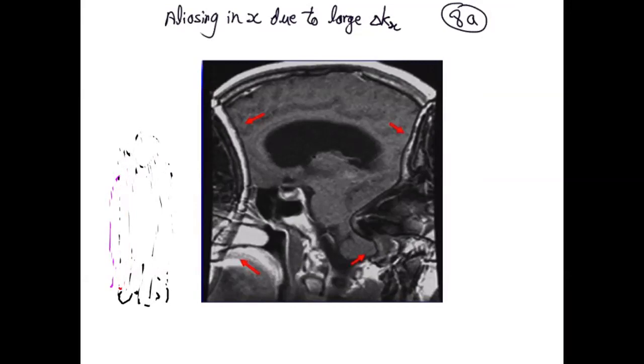A patient lies in the scanner, right? And then they could either put their hands up here, or I'll do the Leonardo da Vinci thing, can put their hands over here. Which one is more preferential if you want to image the abdomen? It depends on the size of your field of view and the bore probably, but you would want them out if you need to be looking at a narrower area.